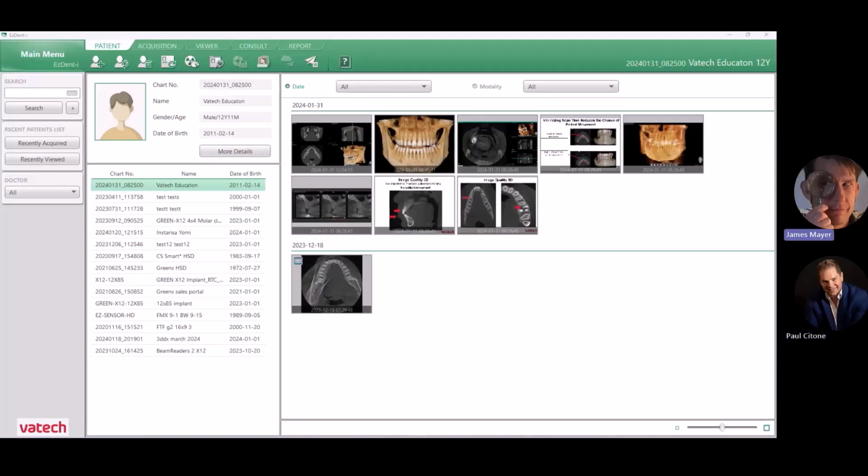For sure, and I think that also means the patient's still there, and then do I need to retake the image because I've just evaluated? So that's going to save a lot of headache for the office and the patient.